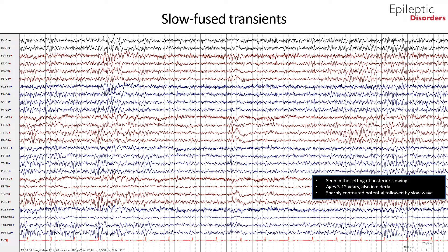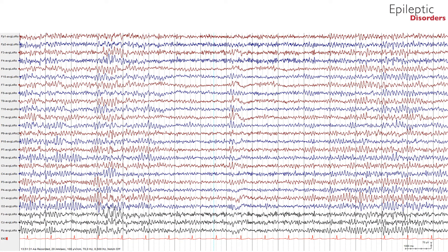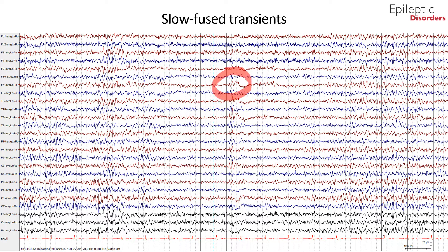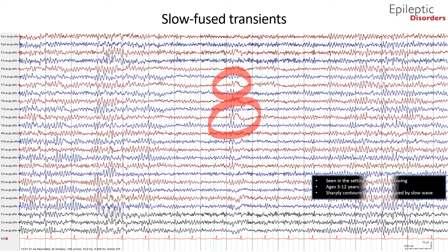This is a bipolar montage EEG showing slow fused transients as outlined by the red circles. Note the sharply contoured potential that blends together with the ensuing slow wave giving the appearance of slow fused transients. This is an average montage of the same patient showing slow fused transients prominently over the F7 and T7 channels — a sharply contoured potential followed by a slow wave.